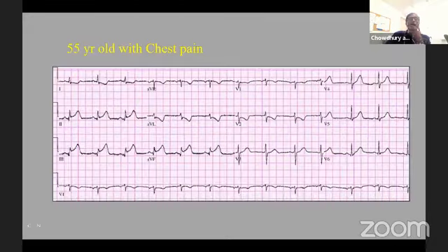So this is another patient with that LAD that we intervened. So this is a 55-year-old with chest pain. What to do? So I tell my fellows to evaluate this patient quickly. Does the patient have any comorbidities, on any medications?